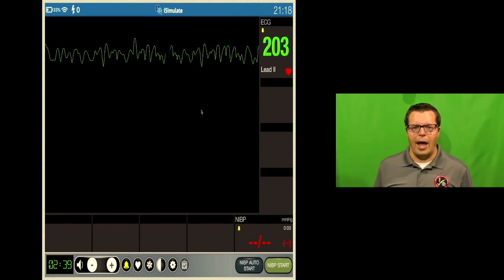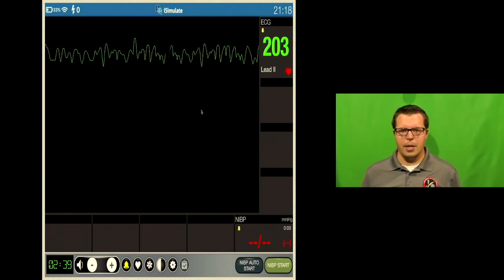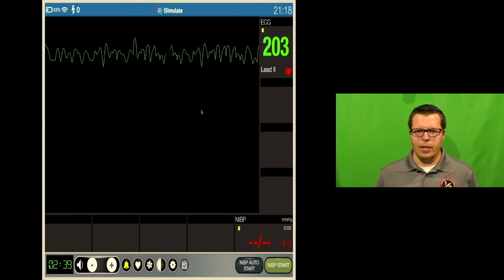If they've had a long apneic period, their CO2 may be 60 or 70. But if you leave them on just reasonable vent settings for a couple of minutes, they likely will blow that back down and come back down to a normal level. So once you put somebody on the vent or once you make a change, give them a couple of minutes to equilibrate, and then we can see what happens.